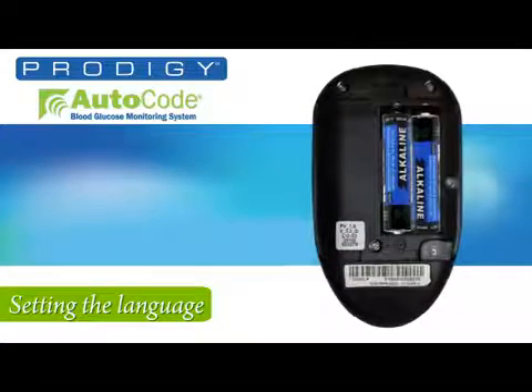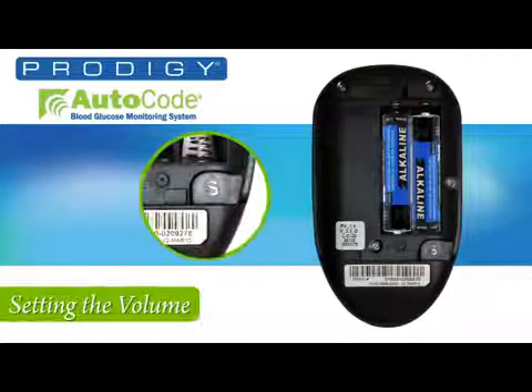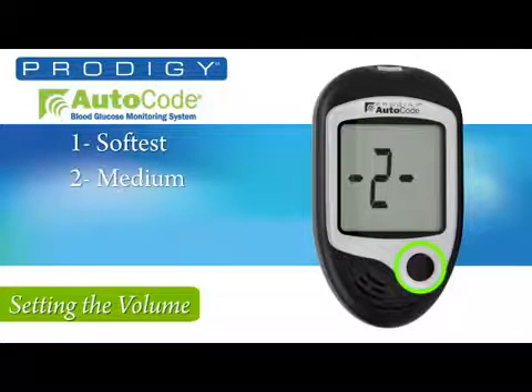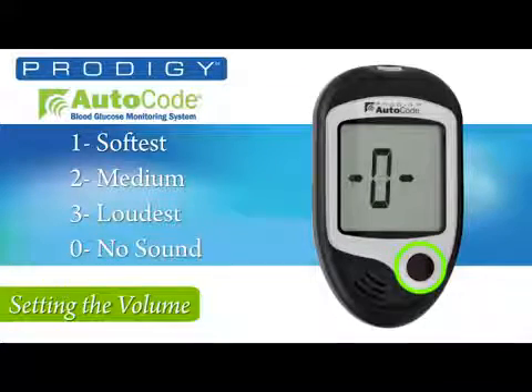Flipping the meter over, press the set button and then go back to the front to set the volume. As you set the volume, you will hear a chime to let you hear the different volume levels. Simply choose from 1, 2, or 3 for different sound levels, or choose 0 if you don't want any sound.